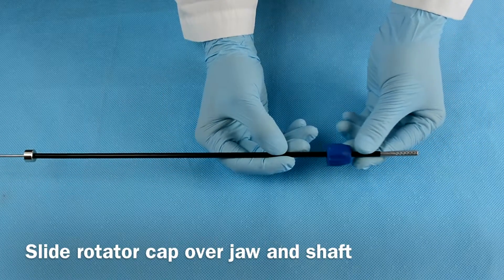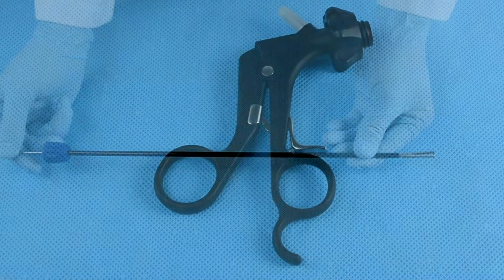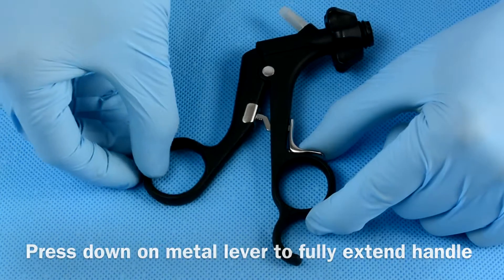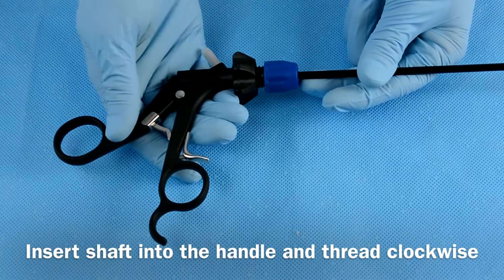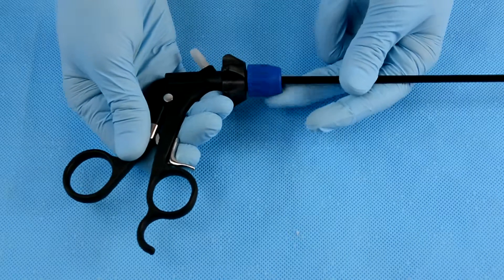Slide the rotator cap over the jaw and shaft until it reaches the opposite end. Fully extend the handle by pressing down on the metal lever and allowing the handles to come apart. Insert the shaft with the rotator cap into the fully extended handle. The jaw will close and the handle will lock into place.